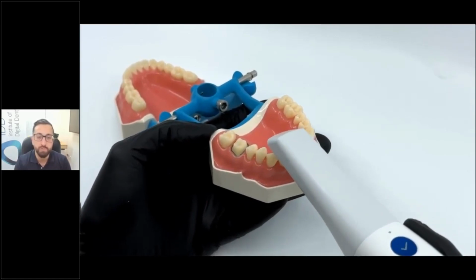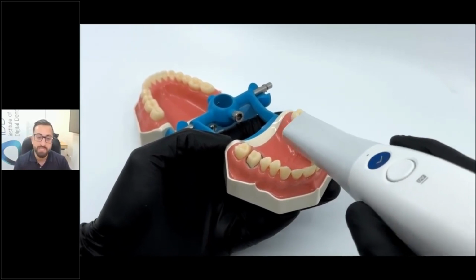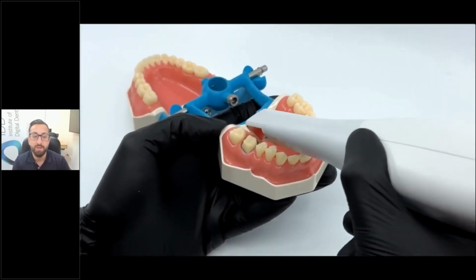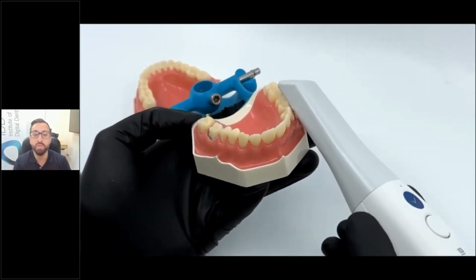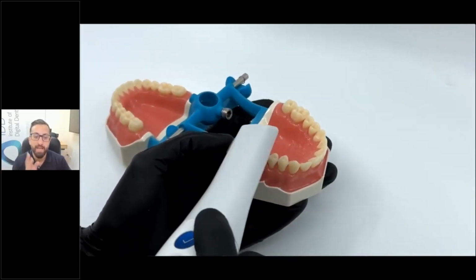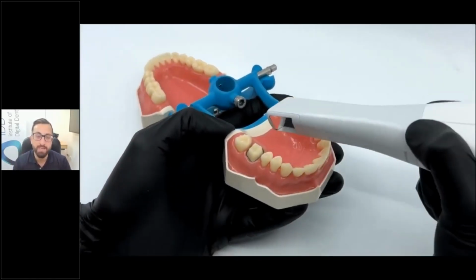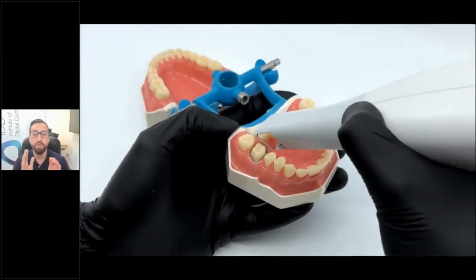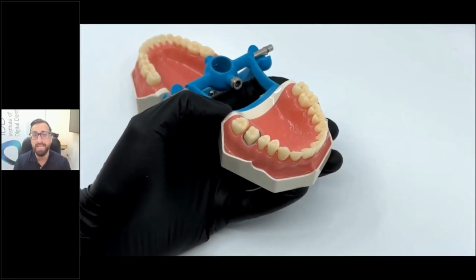You start on the occlusal, go all the way to the other side, make sure you capture the incisal edges, rotate, capture all the palatal surfaces, rotate, capture all the buccal surfaces. You want to practice this as much as possible so that you can do this in one pass. You don't want to start and stop too much. And then you can see here my technique to get the occlusal contacts. It's really important to realize, this is tip number one, that when you do your scanning strategy, a lot of people get really caught up in capturing every single bit of data on their first pass. And that's not actually what you're supposed to do.